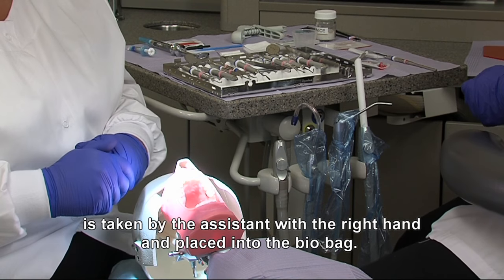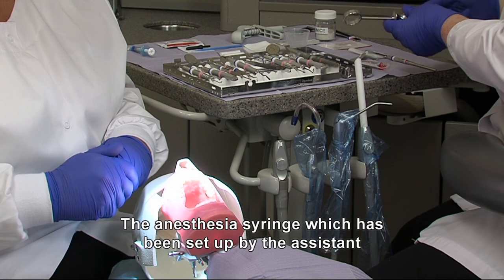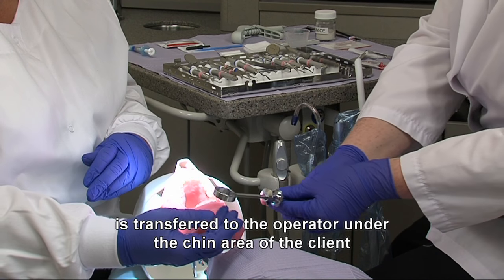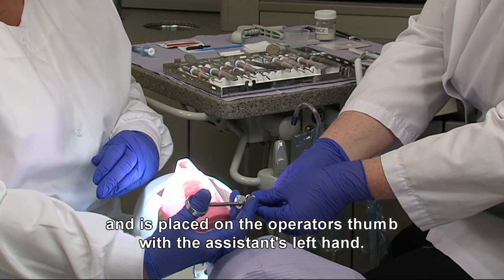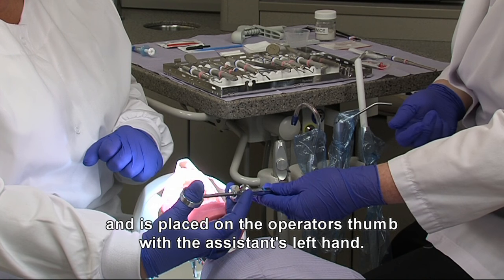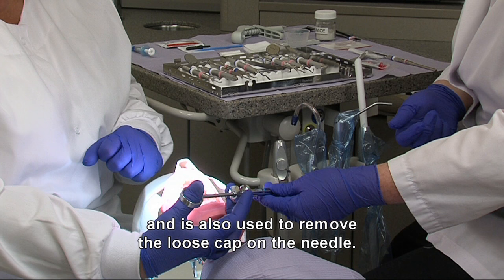into the biobag. The anesthesia syringe, which has been set up by the assistant, is transferred to the operator under the chin area of the client and is placed on the operator's thumb with the assistant's left hand. When the assistant's right hand is free, it can help steady the syringe if necessary and is also used to remove the loose cap on the needle.